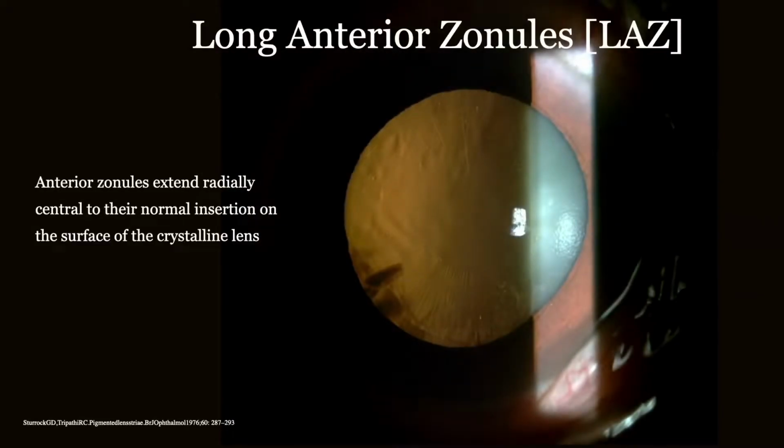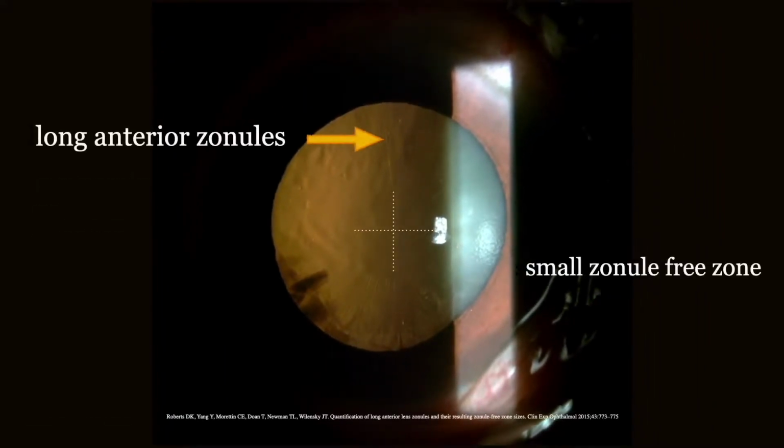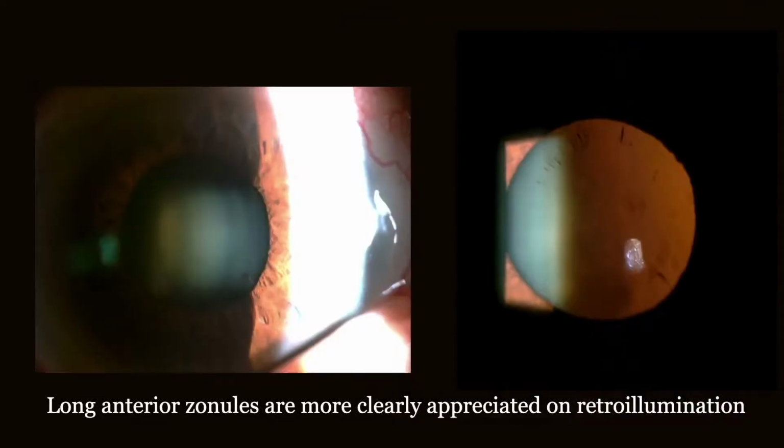Long anterior zonules are anterior zonules which are inserted beyond the normal insertion on the anterior lens surface, leading to a small zonule-free zone. They are present in about 2% of the population. However, sometimes they are subtle in appearance and may be missed on slit lamp examination. The trick is to look for them in retroillumination. They stand out clearly against the red glow.